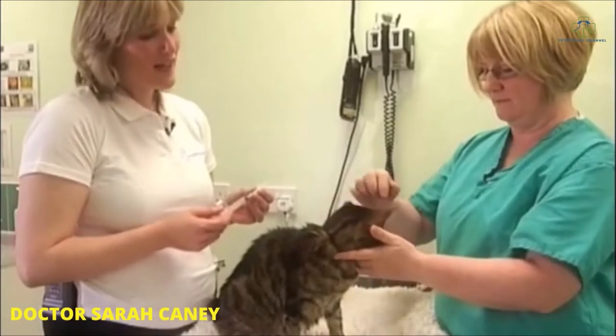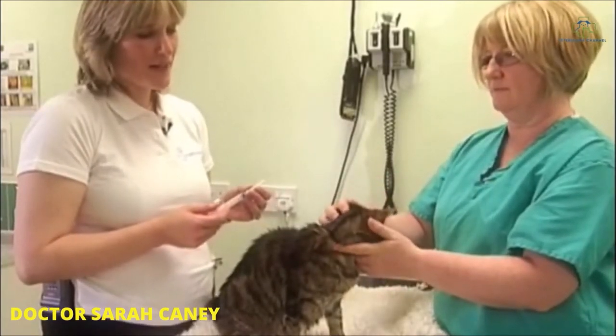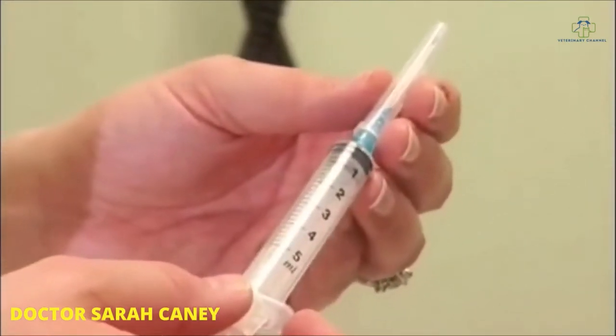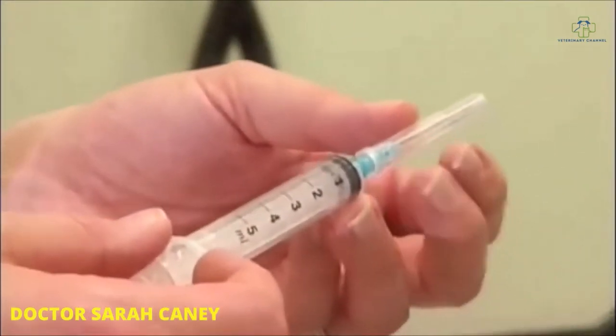The equipment that I use to collect a cystocentesis sample is a five or ten mil syringe and a 23 gauge needle, usually using a one inch long needle.